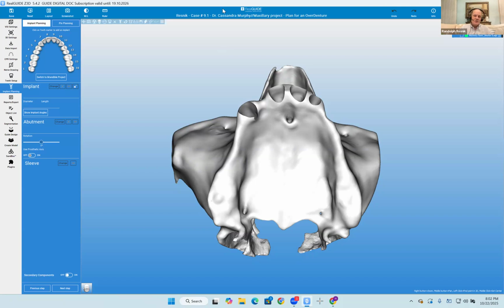So to answer your question, as long as you keep the primary stress-bearing area, which is the horizontal palate, you can remove the flange on those 4 areas that we're going to graft, and it doesn't even have to touch them. So you would make the prosthesis so that it would never be able to touch where the implants are. Okay. Does that make sense?